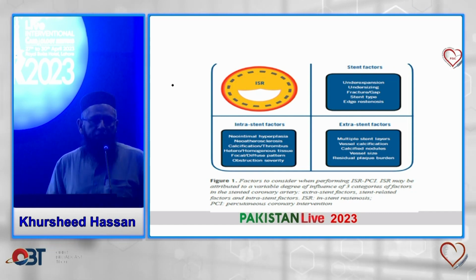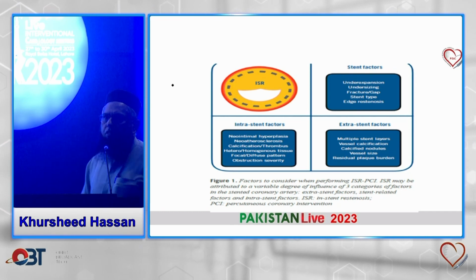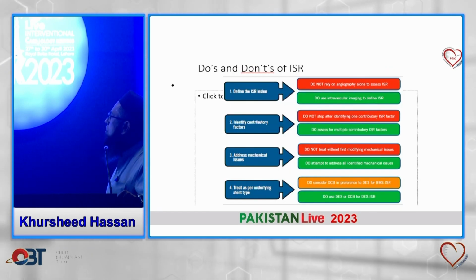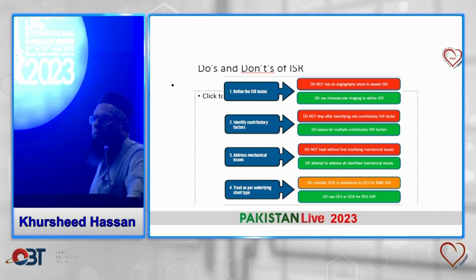Under-deployed stent, under-expanded stent, a lot of calcium, a lot of previously deployed stent, all of these make the expansion of the new stent difficult and lead to ISR. Okay, what do you do when you get ISR?